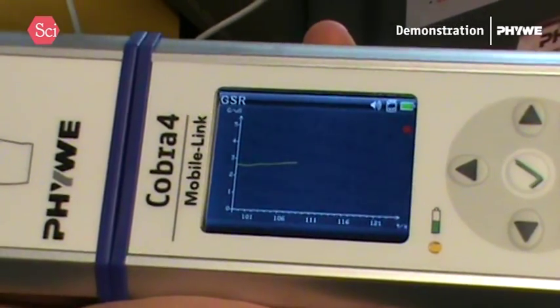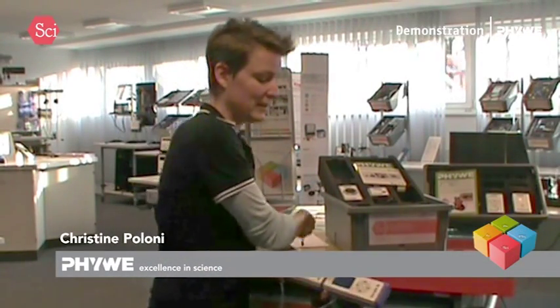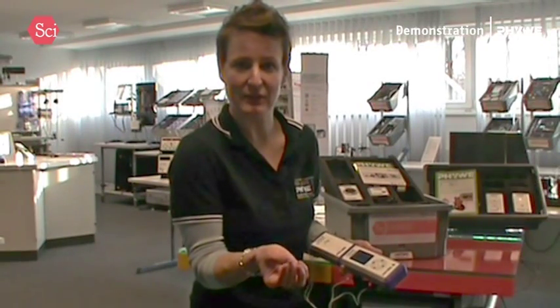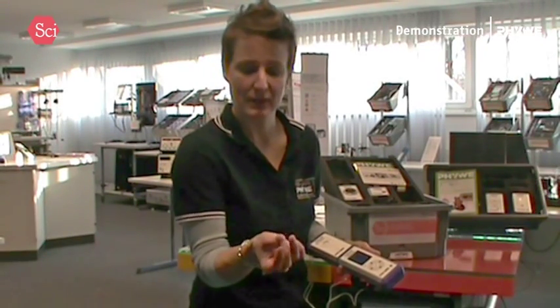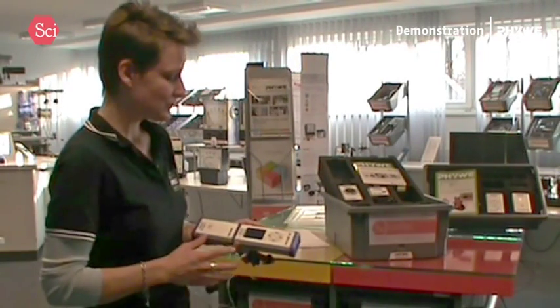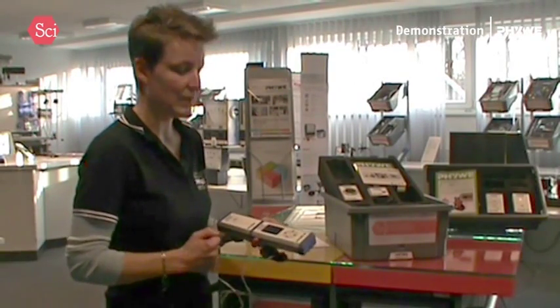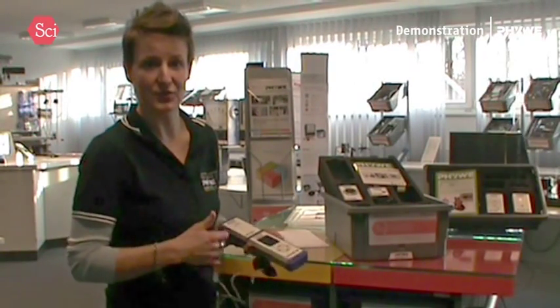And that way you can see if someone is concentrating or not, if someone is lying, if someone is overly happy — because even though you cannot control it, you will still have a little bit of fluids, nearly sweat forming at your fingers. So if I wanted to, I could stop my measurements now and just make the evaluation on my computer.